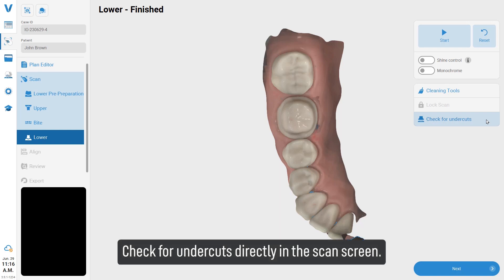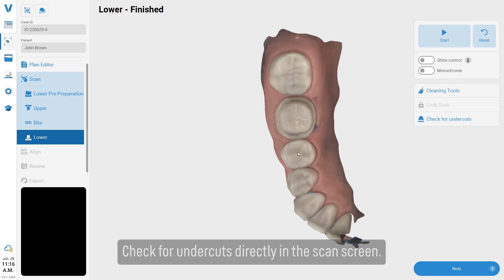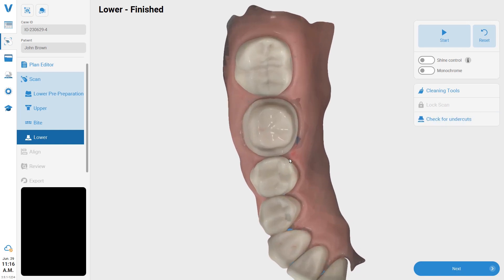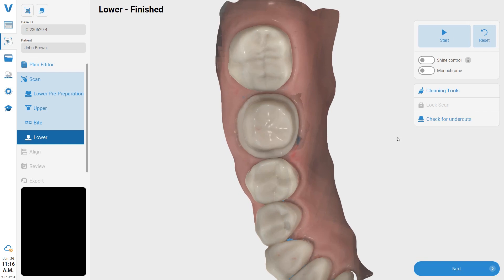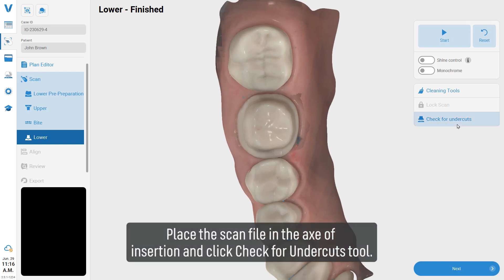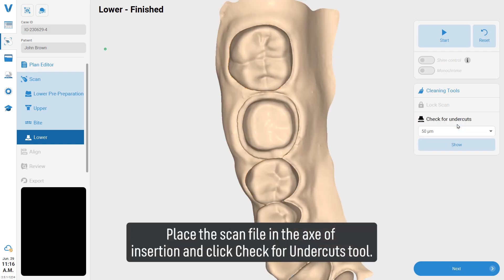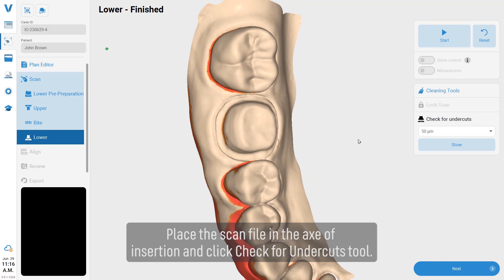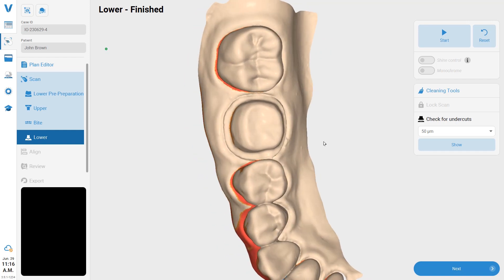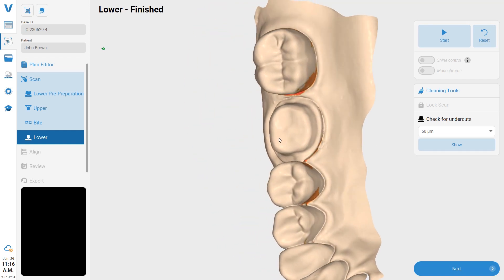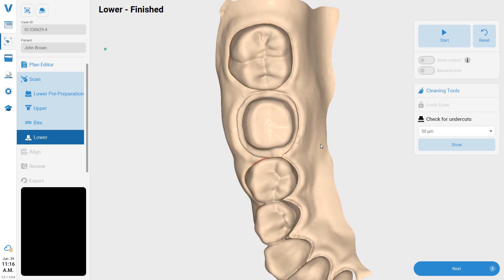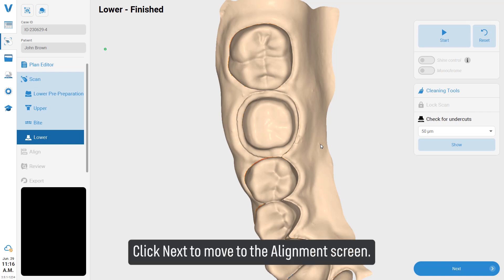Check for undercuts directly in the scan screen. Place the scan file in the axis of insertion and click the check for undercuts tool. Click next to move to the alignment screen.